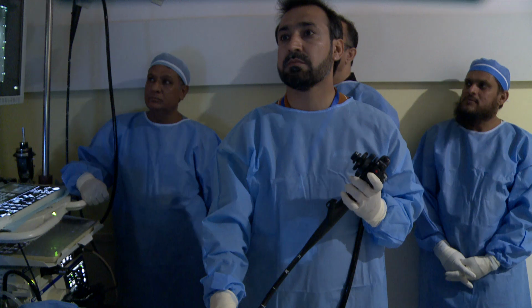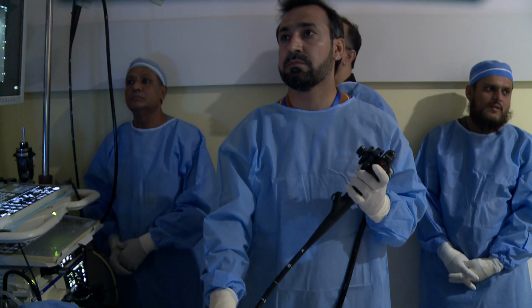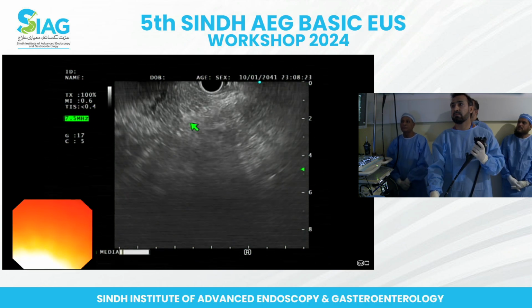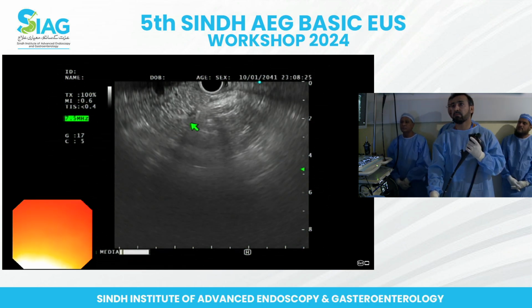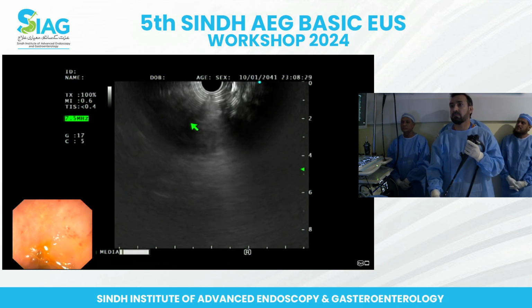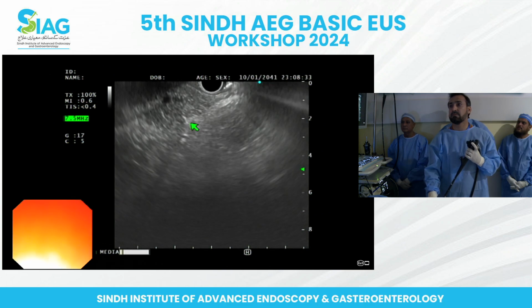So Dr. Mushtaq Safi is basically trying to show us portal vein followed by pancreatic duct and then common bile duct. So we are at the D1 at the moment. He needs to come back and introduce the endoscope again. So whenever a person is lost, especially at the training stage, he needs to come back and start all over again at that station.